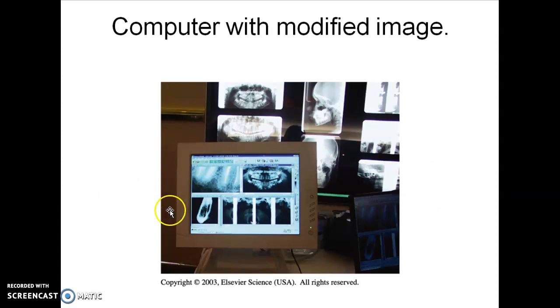This is another image just showing you what the digital images can look like, and they're able to zoom in. These are the apices of teeth out of either this full mouth, of this pan, or of a separate image from a full mouth. And it looks like they're also looking at the TMJ area here. I'm not sure what this is. This could be just width of the mandible kind of a thing. But they have lots of extraoral images, different angles, things like that, just showing you how the different images look. So this was the end of part 2 of digital imaging.